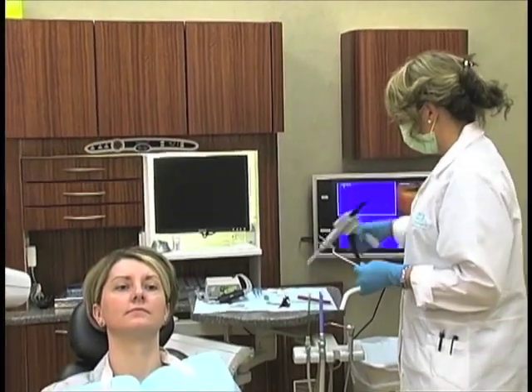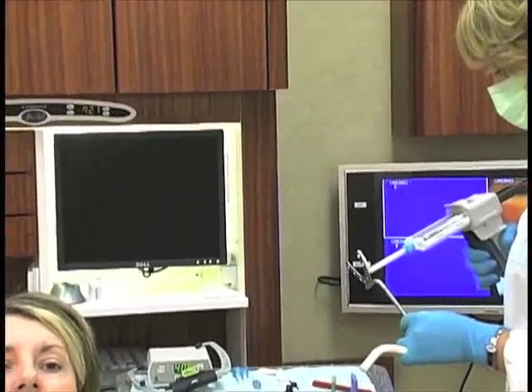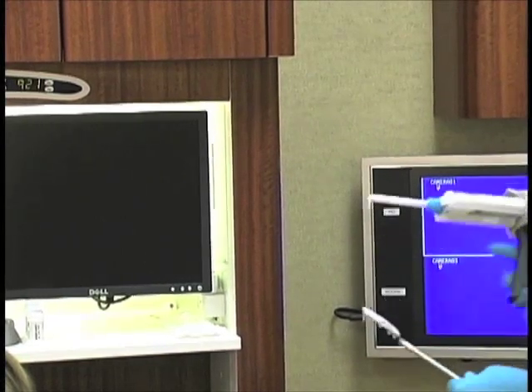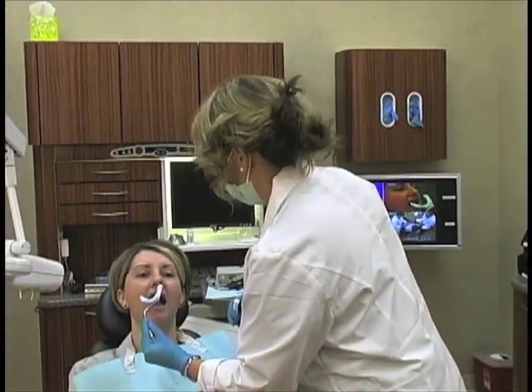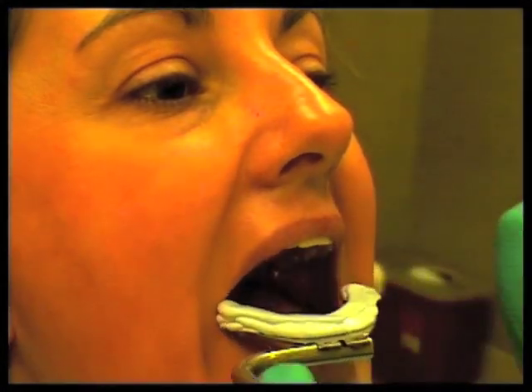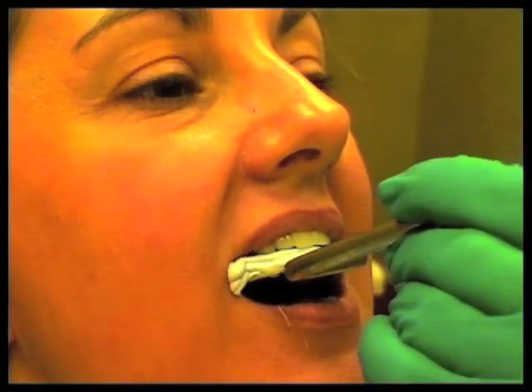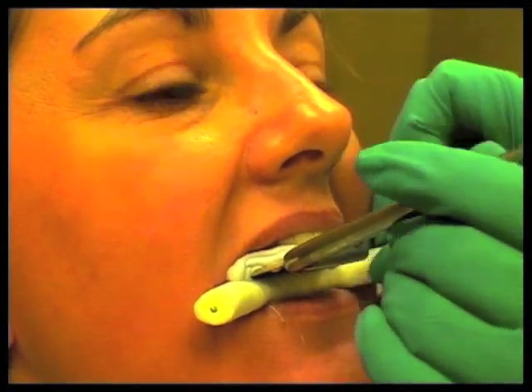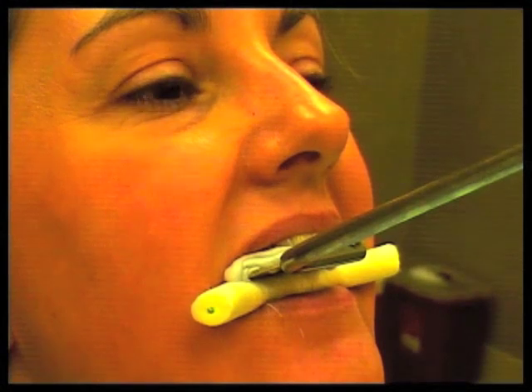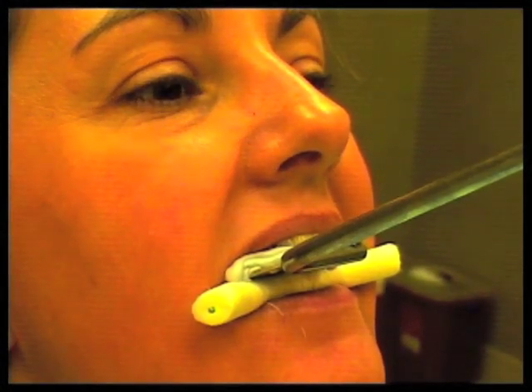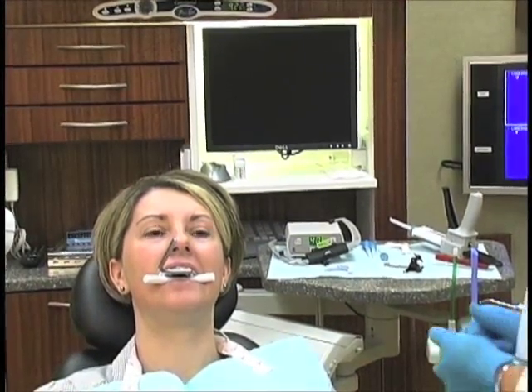The next thing we're going to do is stabilize the bite fork. We like to use a polyvinyl material — a polyvinyl bite registration material that gets squirted onto the bite fork. You can also use compound if you prefer, but this is very easy. She pauses just outside of her mouth so you can see it. That little line on the face bow is always going to be up. We seat it against her teeth and use a light bite or a large cotton roll to stabilize it. Once that gets nice and hard, there's only one place that it fits. I've seen doctors try to have the patient hold it — this is just a simple way to get that part of the process done.